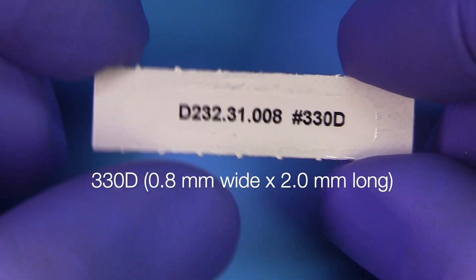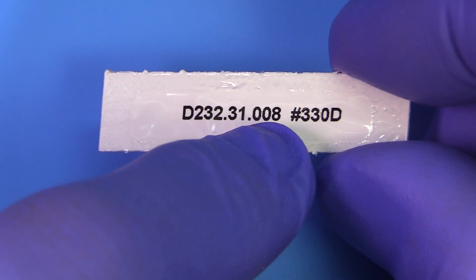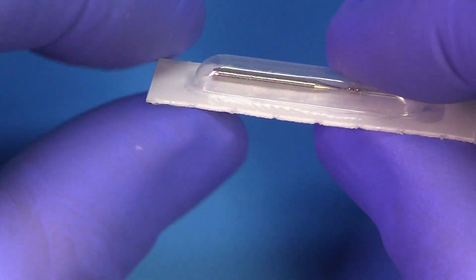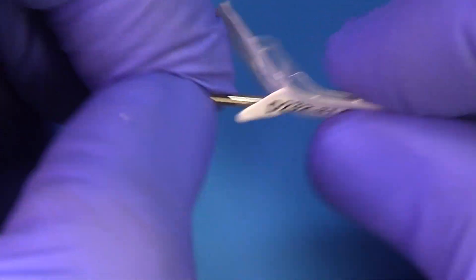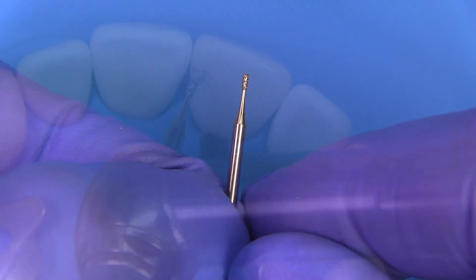I like to use a diamond bur. Why a 330 diamond? Because this enamel is really hard. When you pop the bur out of the packet, make sure you grab it by the head and push out the back of the shank so you don't end up bending these small burs — it's really easy to bend that tip if you push from the other direction.